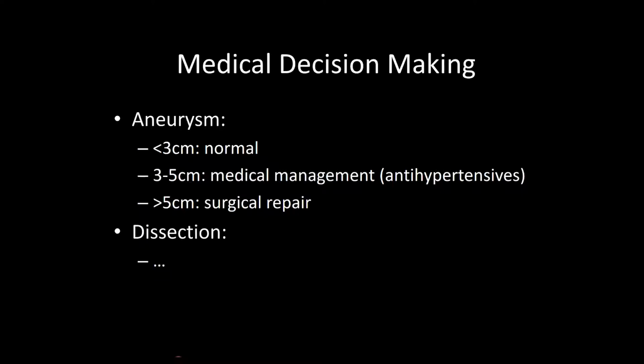As mentioned before, ultrasound is specific for aortic dissection, but not sensitive. So if you have a high clinical suspicion for this diagnosis and aren't seeing it on ultrasound, additional testing, such as a CTA, should be ordered to truly rule this out.